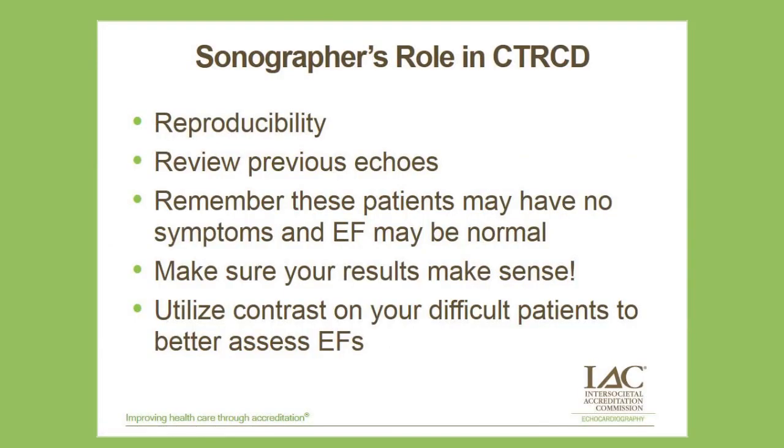So sonographer role in cardiotoxicity, I think the biggest role is to get past that sonographer learning curve with the strain and produce reproducible strain imaging. I would also encourage the sonographers to review the previous echoes and just see what the patient looked like previously as far as their ejection fraction and their global longitudinal strain. And remember, these patients may have no symptoms, and their EFs may be totally normal, and their strain may be abnormal. So we have to watch for that.